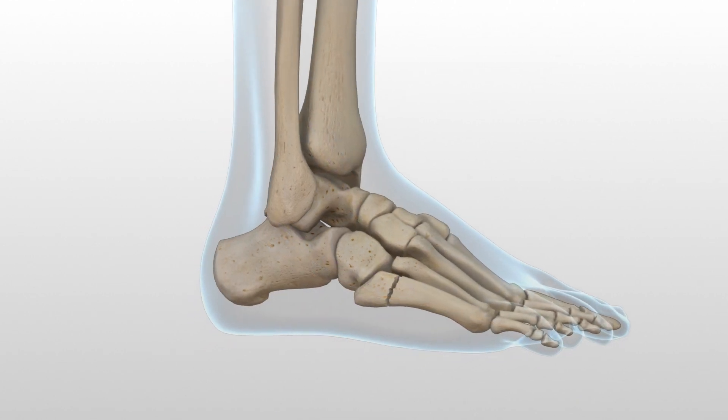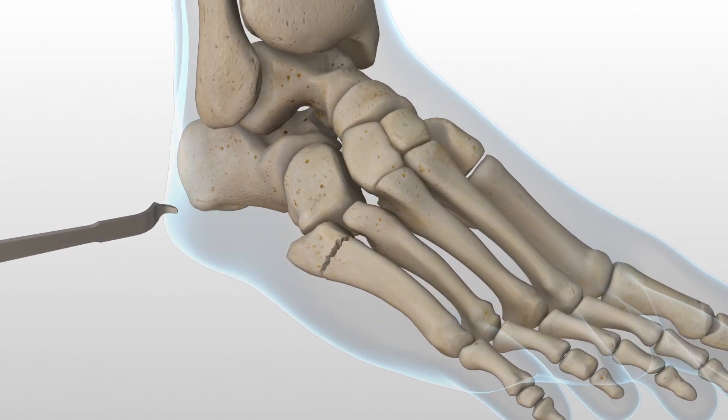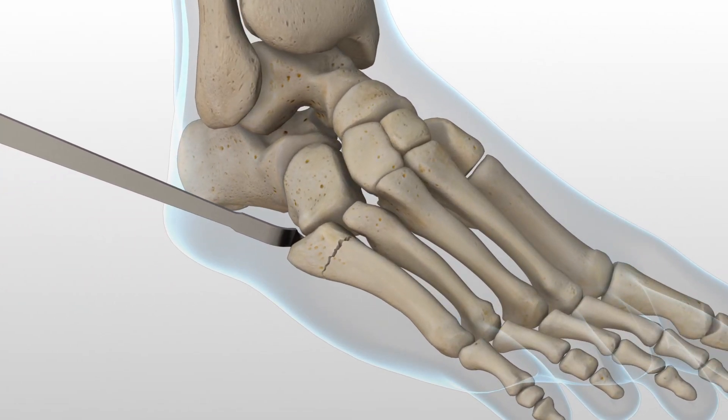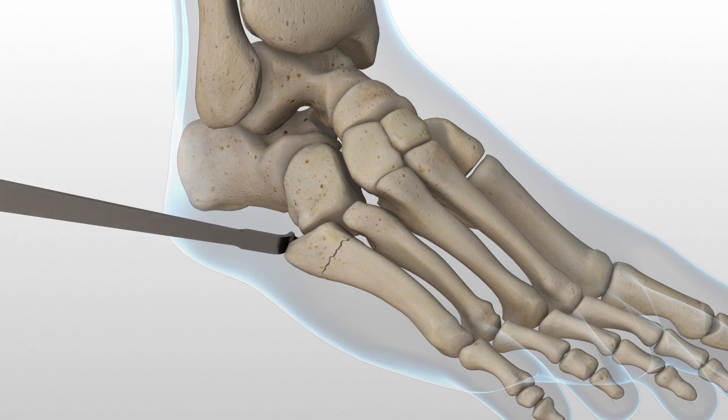A mini Hohmann retractor is placed on the plantar aspect of the fifth metatarsal to deliver the base into the appropriate position. The surgeon's fingers can then be used to reduce the fifth metatarsal fracture by placing them in between the fourth and fifth metatarsals and applying pressure.